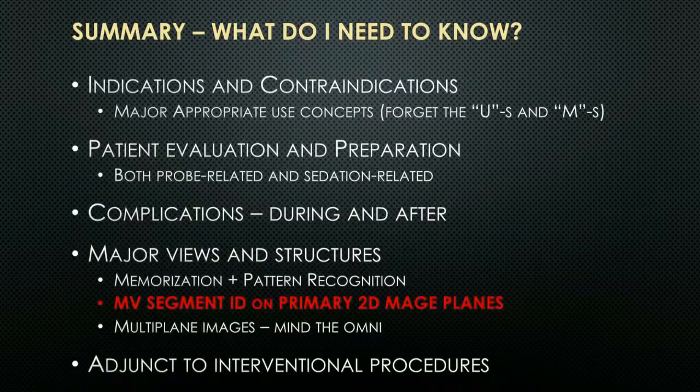There's a big focus, obviously, on probe sterilization, and we keep the cleaning machines up to the latest guidelines, and they're brand new, and we clean the probe several times with several different agents. But nobody's come to me and said we need to use a sheath yet. Okay. That could be interesting.